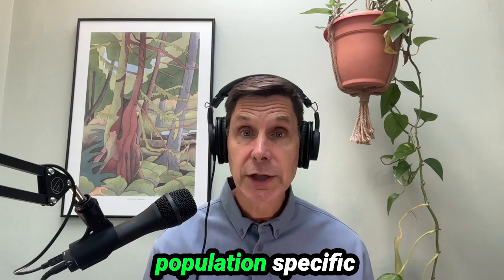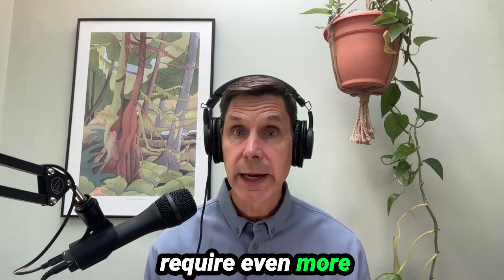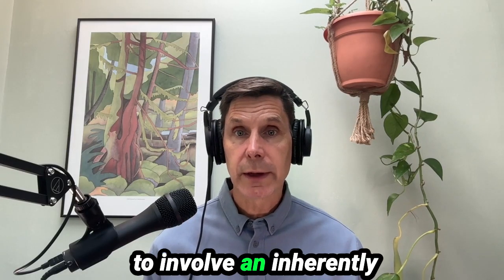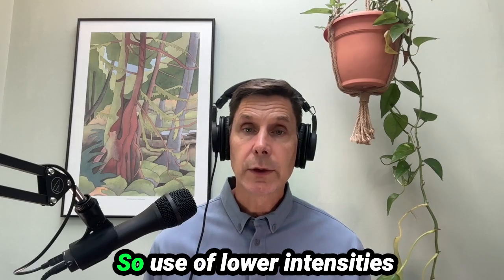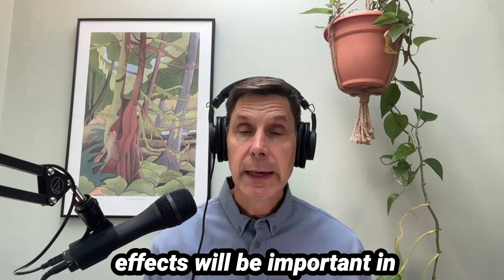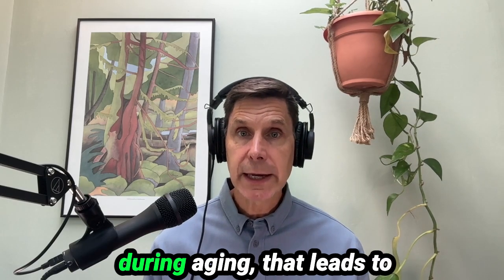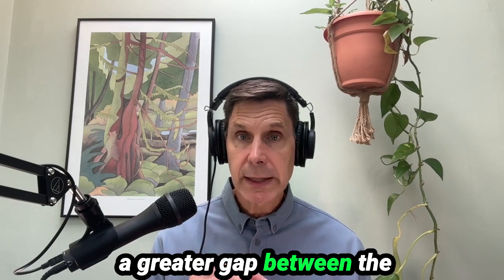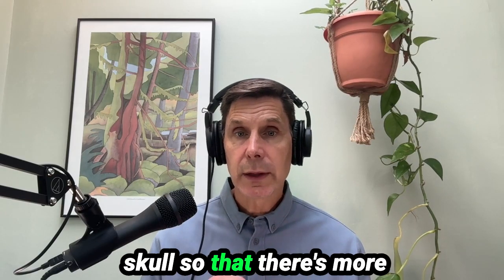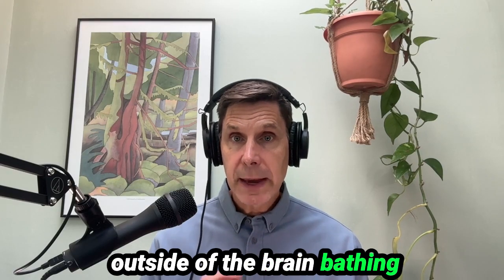Now let's look at some population-specific considerations. Certain special populations require even more tailored protocols. For example, children with smaller heads is going to involve an inherently different current flow. So use of lower intensities and close monitoring for side effects will be important. In older adults, because of the cortical atrophy that occurs during aging, that leads to a greater gap between the outer surface of the cortex and the inner surface of the skull, so that there's more CSF or cerebrospinal fluid outside of the brain bathing the brain.